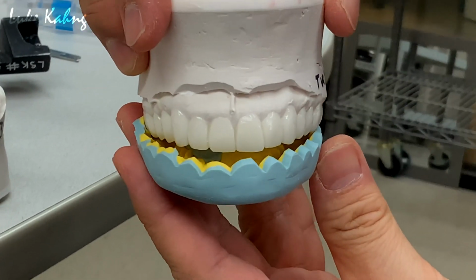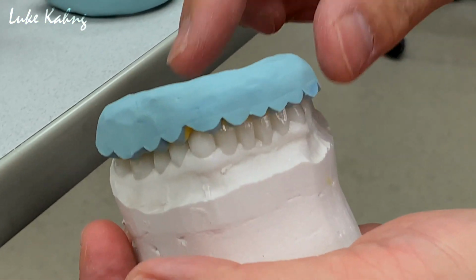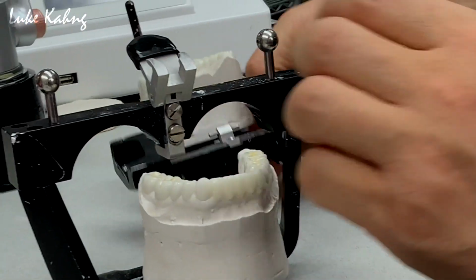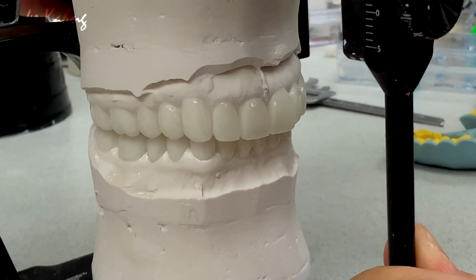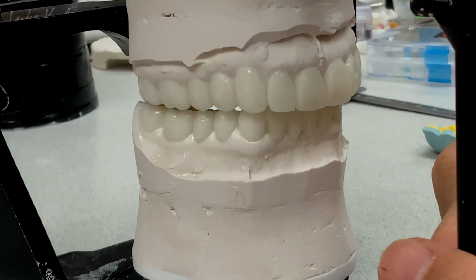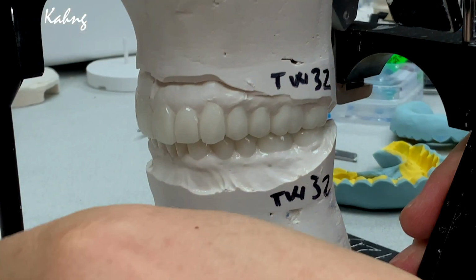All right. Same as this, the lower, same thing. Make sense? Now, this is the best part. We have to set the articulations correctly. And then we have to set up just like this. Now we see, open it. And then we see the movement. That's the beauty of the treatment plan wax up art.